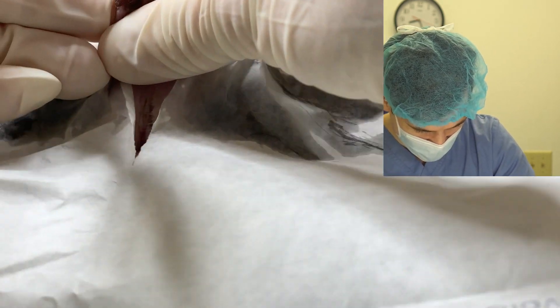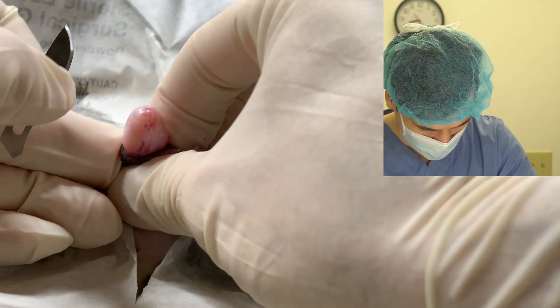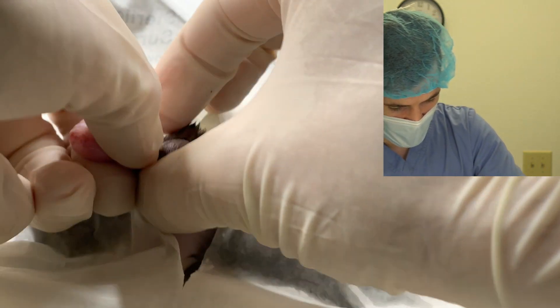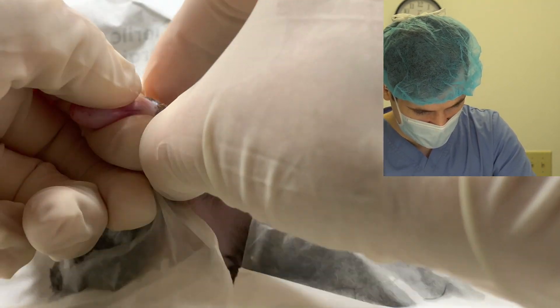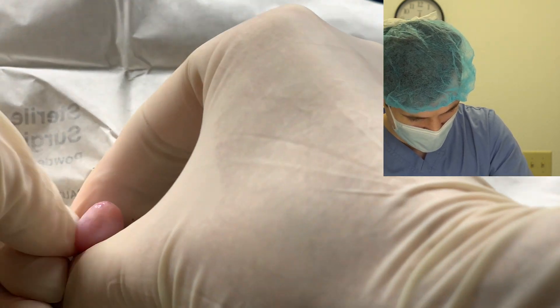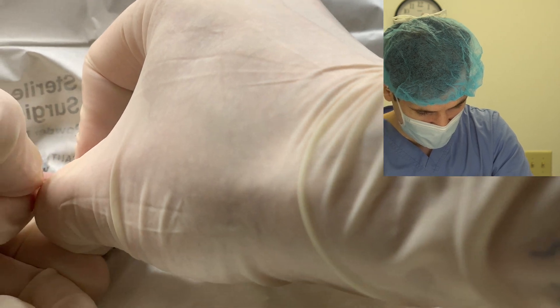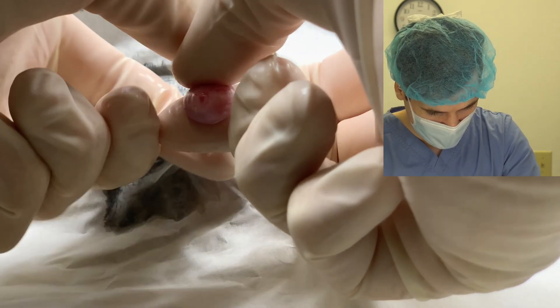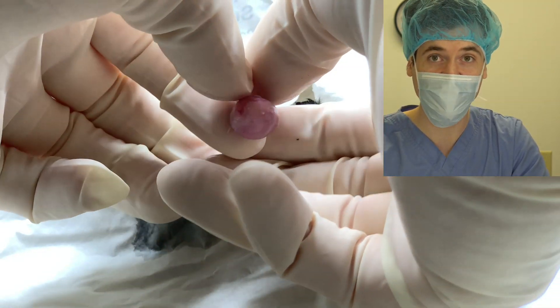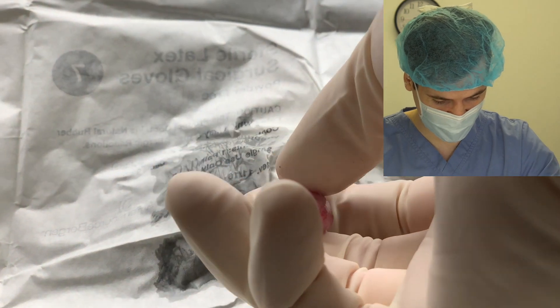I'm gonna push his testicle right on out like so. That one's coming out. Now I'm gonna place traction on that testicle and we'll start breaking down all of the connective tissue around it — it's just gonna pop out like so. There we go.